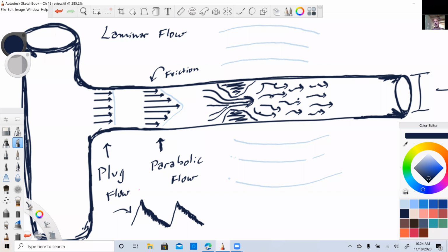Sometimes if you hit pause or freeze at just the right time, you'll see dark red just on the outside edges of the vessel. And then if you have aliasing, you'll have yellow or maybe even blue, but in any case a different color in the middle of the vessel. That's because along the edge of the vessel the blood is really slow, the very first layer is very slow, and then it goes faster, faster, faster.